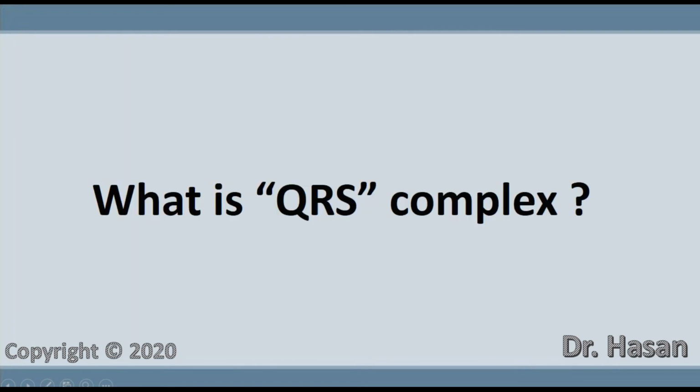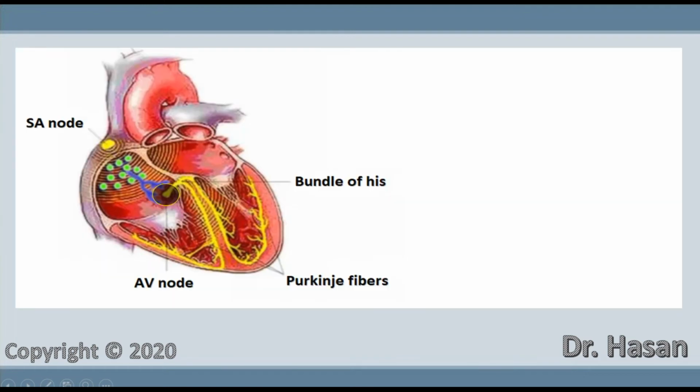What is the QRS complex? We can already understand that the QRS complex will reflect ventricular excitation. From the AV node, the excitation is further transmitted along the His bundle. Let's show in the figure a recording electrode. Why is the recording electrode shown in the figure?